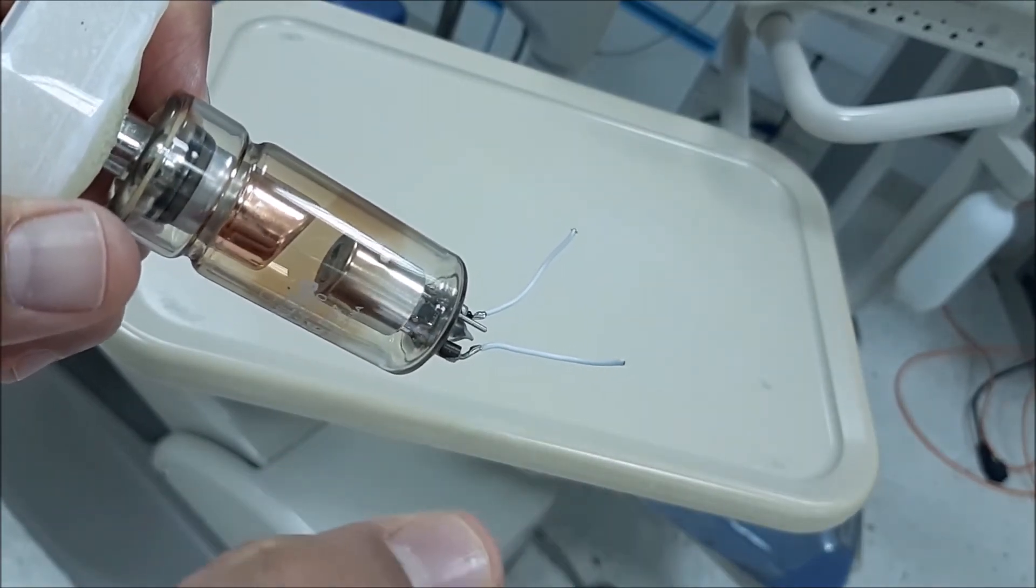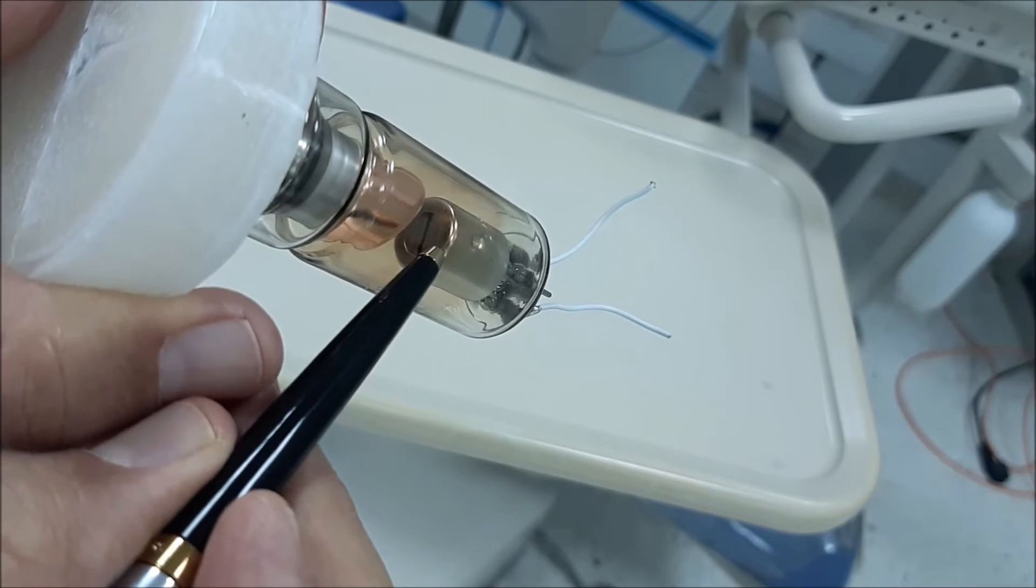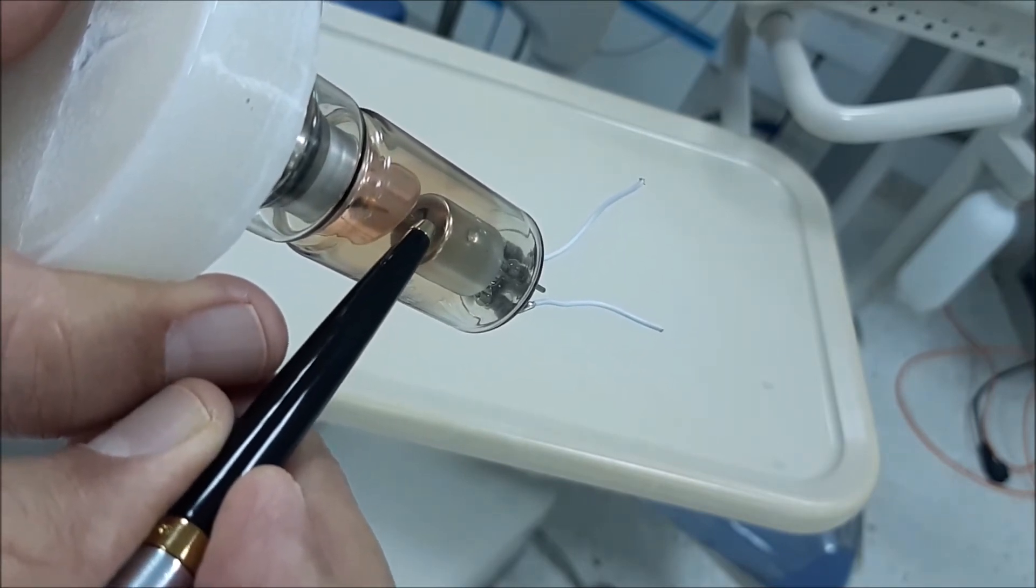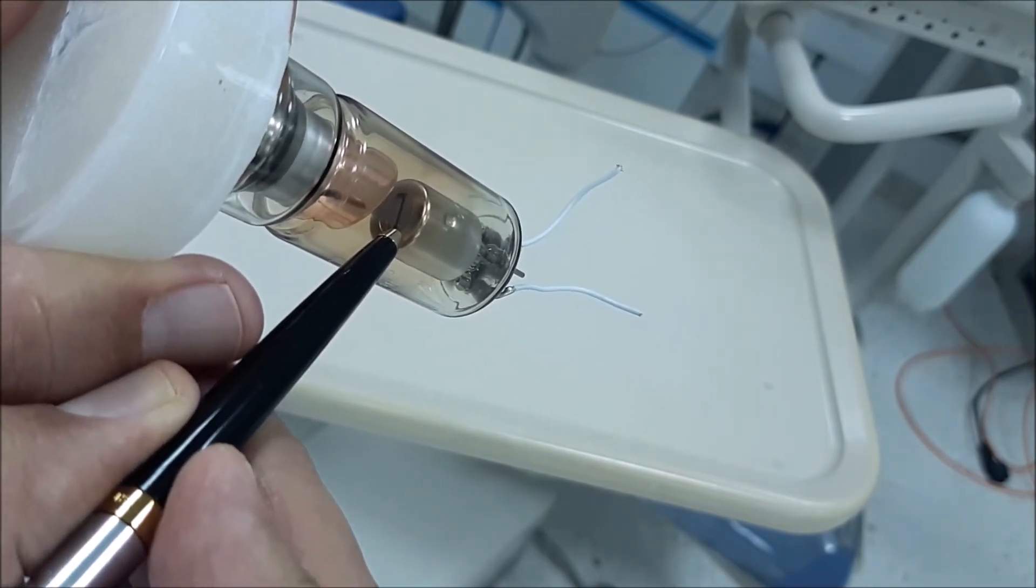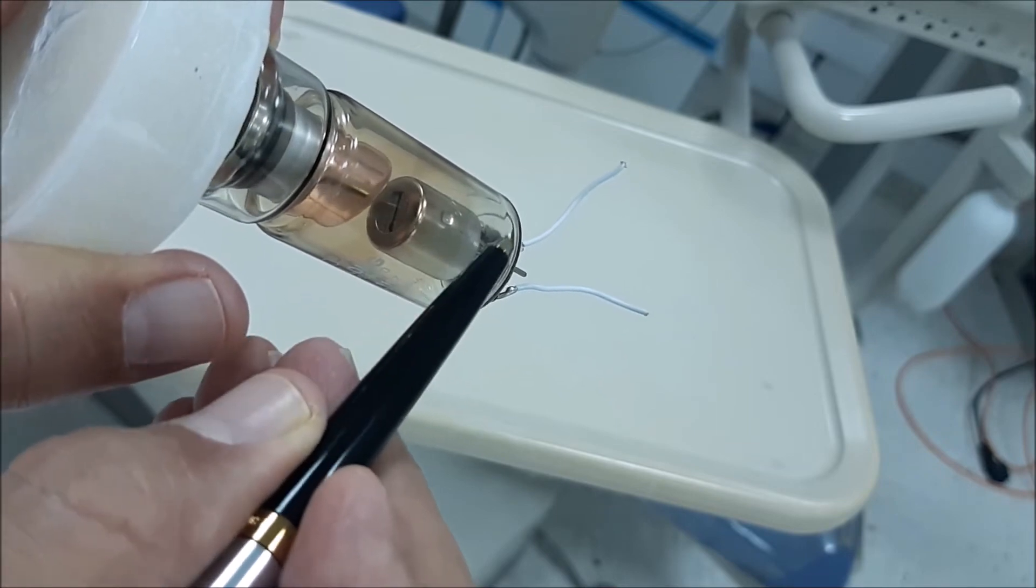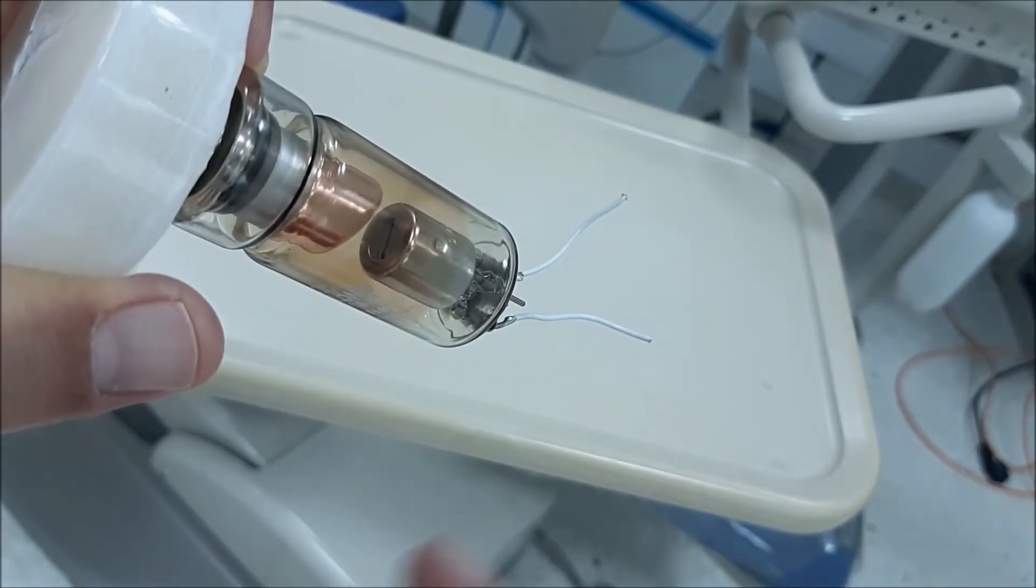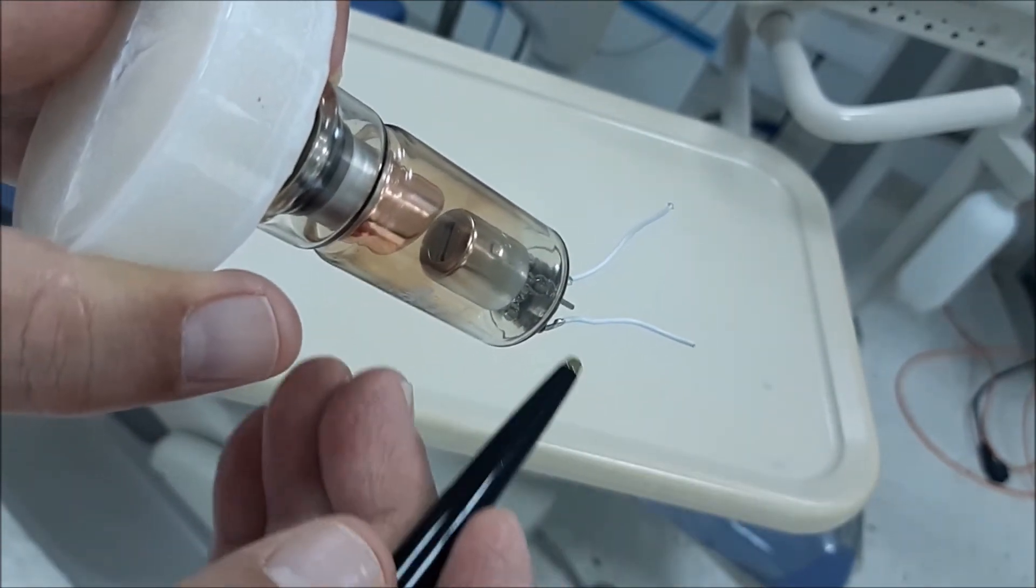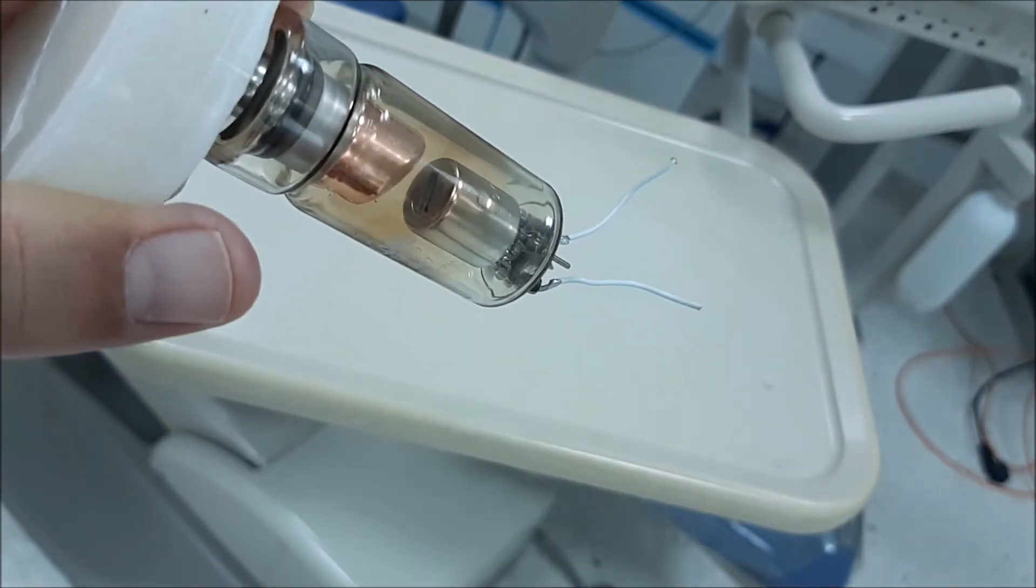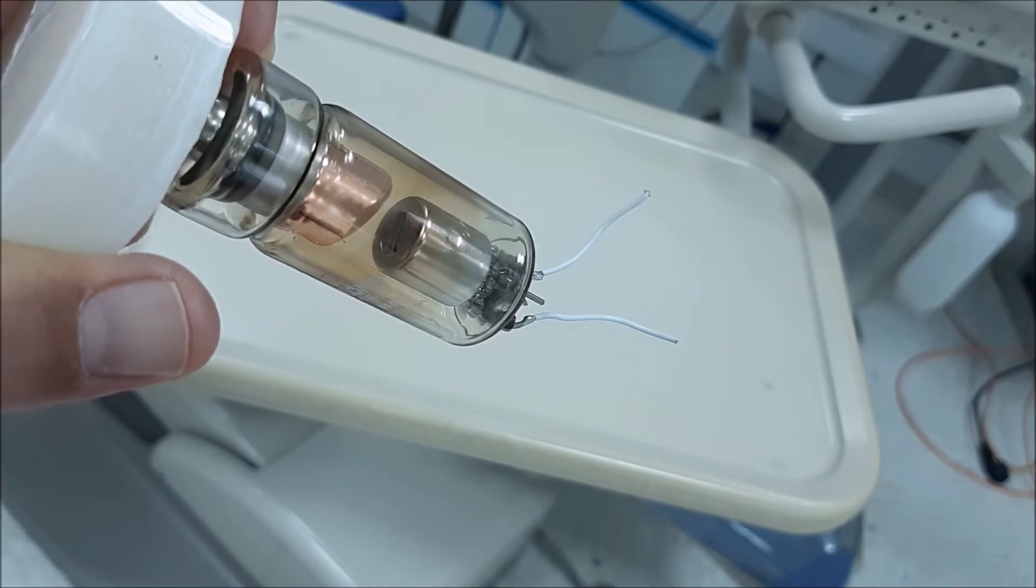So the first step when you start your X-ray machine is you're going to heat up this tungsten filament, which is present inside the cathode, through the step-down transformer.